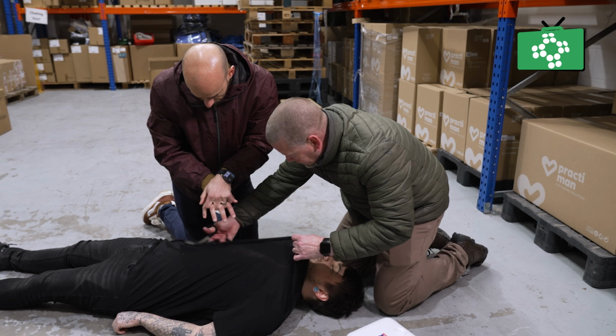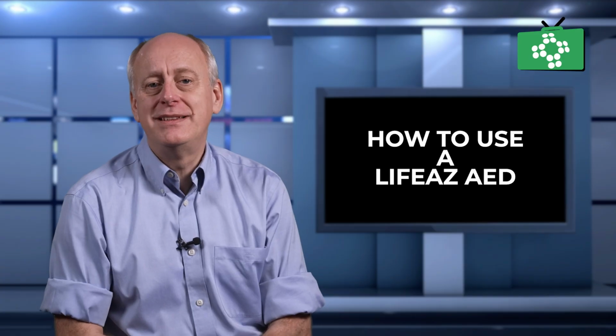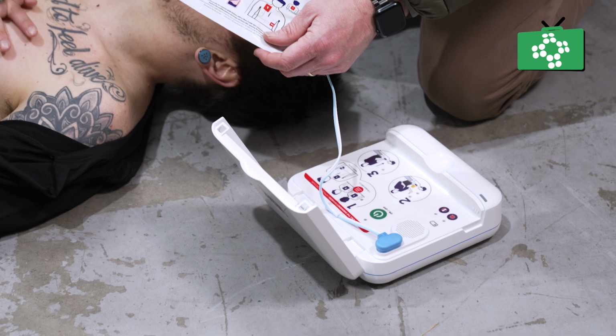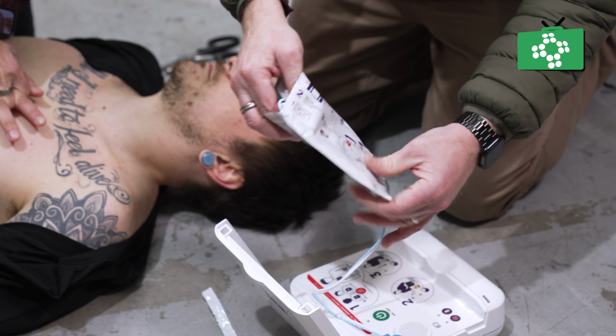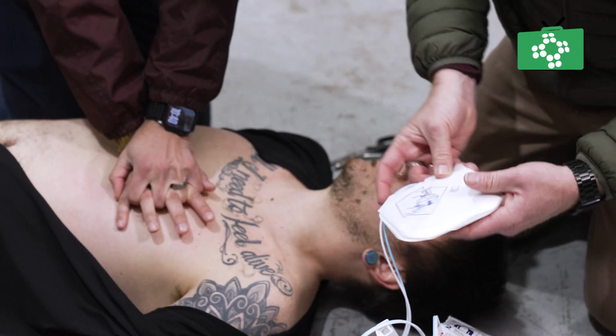Remove or cut clothing on the chest to ensure the pads directly connect with bare skin. This includes removing any bras or other items that may interfere with the pad placement or the shock process. Quickly inspect the chest area for pacemakers or surgical scars to identify if a pacemaker is present, and avoid placing the pads directly over it. Pacemakers are usually fitted away from where the pads go.